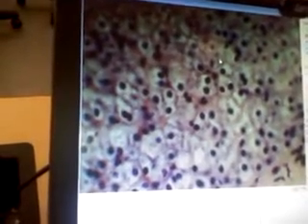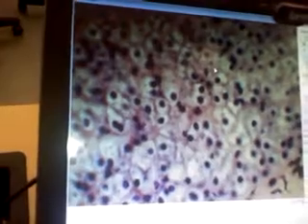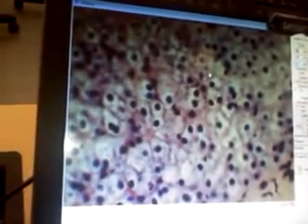Then once it's oxygenated, you bring that blood back in through the celiac trunk and into the hepatic artery, and you provide all these cells what they need, especially the hepatocytes, the abundant cell in this slide, so that they can produce the bile that'll then move through the canaliculi and bile duct back to the common hepatic, join with the cystic, and form the common bile duct. Right? So it's a pathway that continues all the way through.